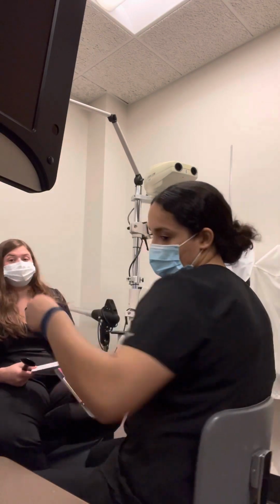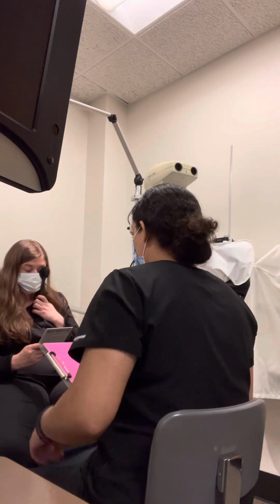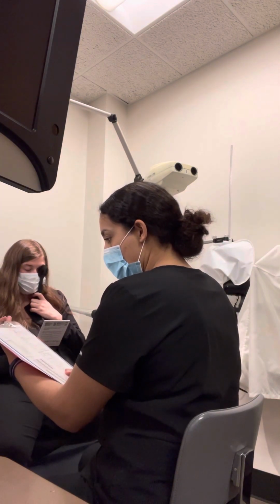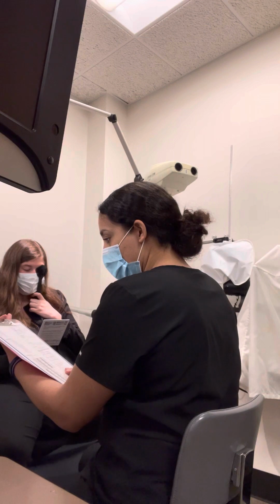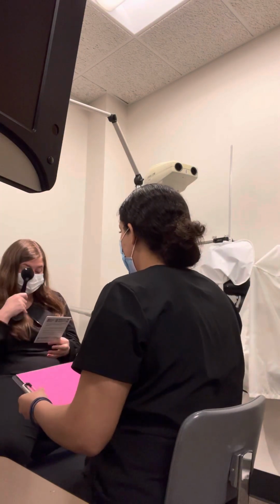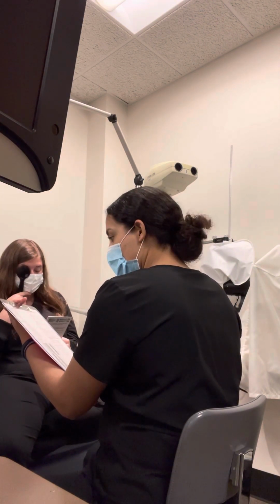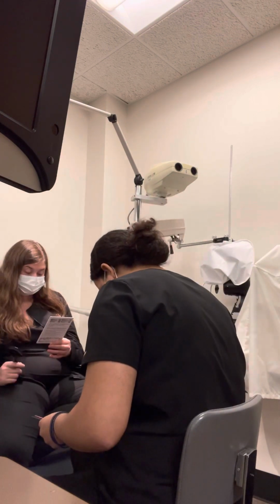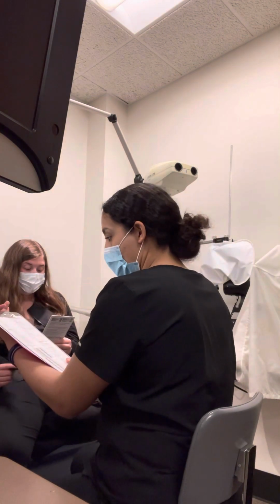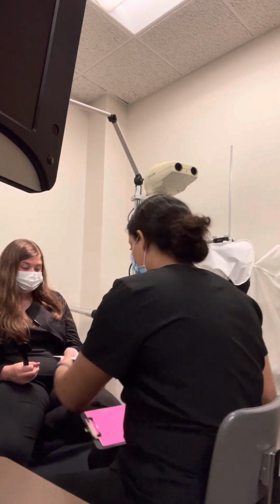We're gonna do the same thing, except without your glasses. Okay, so go ahead and cover up your left eye for me. And without squinting, what is the lowest line you can read for me? LFGNEV. Awesome, thank you. Okay, and cover up your right eye for me. What is the lowest line you can read without squinting? LFGHEV. Awesome, thank you. Okay, and with both your eyes and without squinting, what is the lowest line you can read for me? LFGNEV. Awesome, thank you. Okay, I'm gonna go ahead and take this from you.